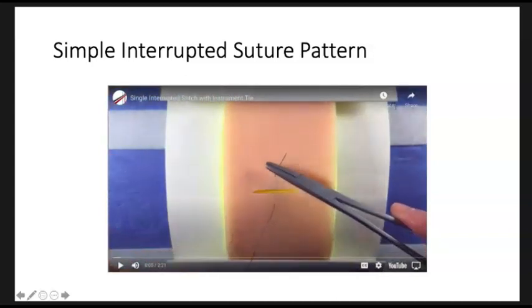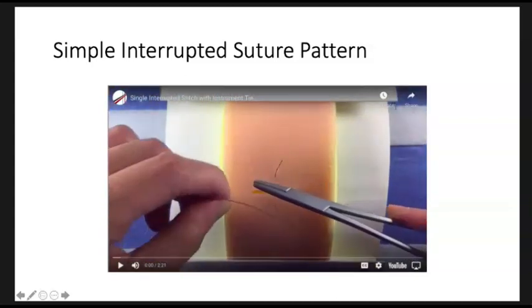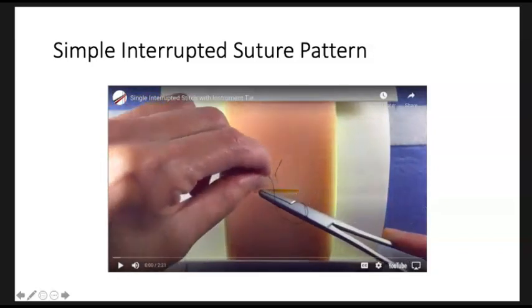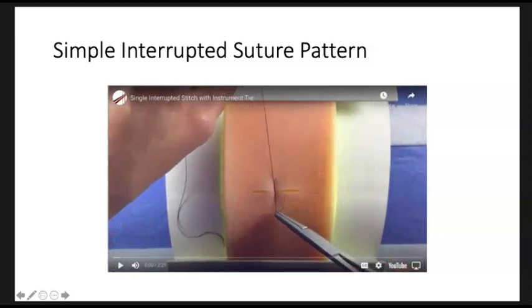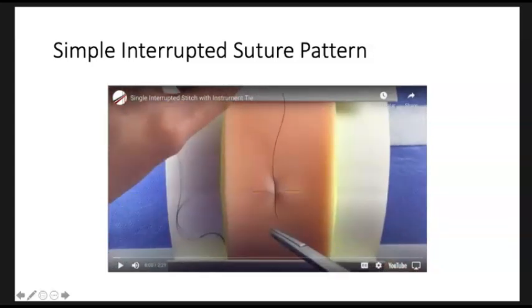To perform the equivalent of a surgeon's knot, wrap the suture around your needle driver twice before grabbing the suture. This will ensure that the first throw is tight and will not loosen when you release the tension on the suture to perform the second throw.